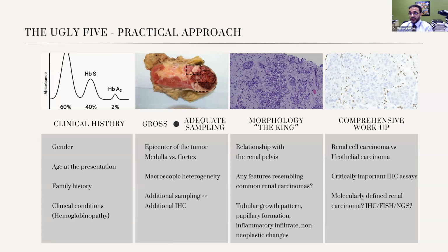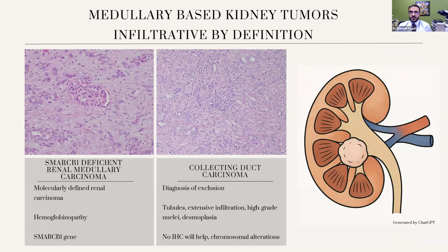And after that, we need to tailor our workup in terms of the findings we have. We shouldn't throw everything we have at any case, including these high-grade infiltrative tumors, but we should have a targeted approach to comprehensive workup. Let's start with the medullary-based kidney tumors.